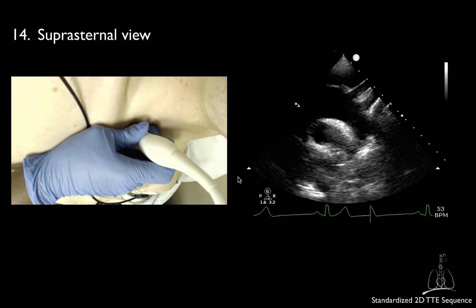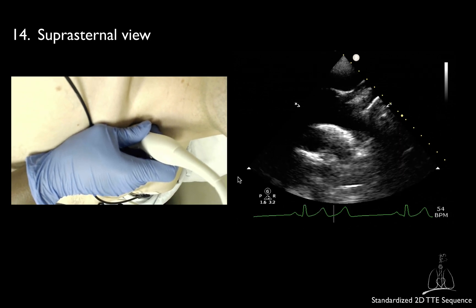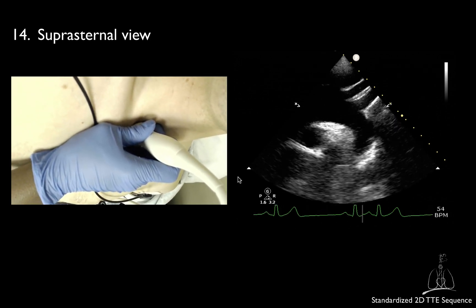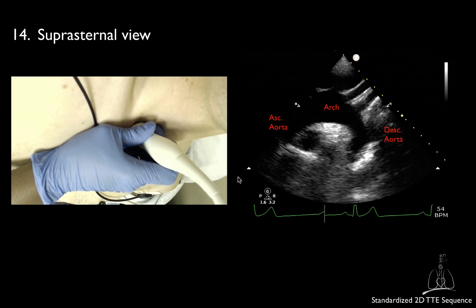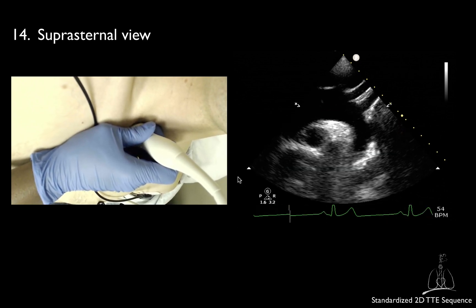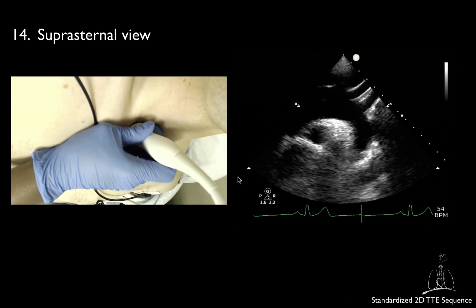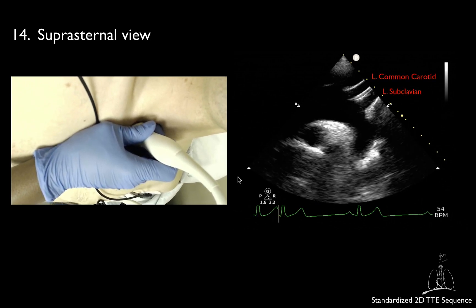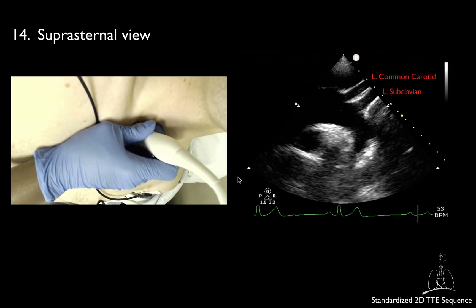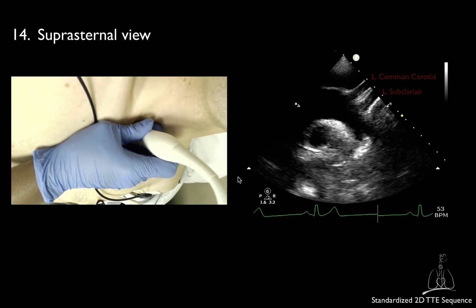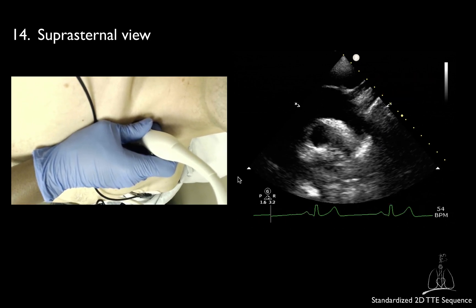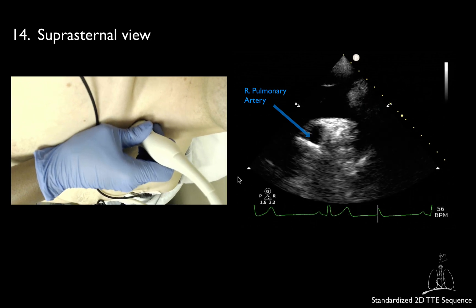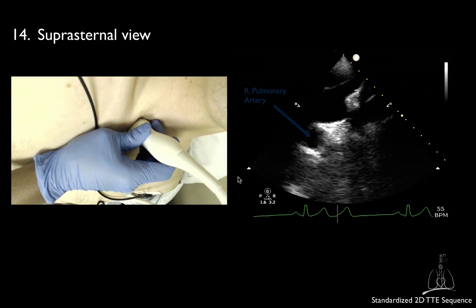The final step of the transthoracic examination is the suprasternal notch view, with identification of the long axis of the ascending aorta, the aortic arch, and the beginning of the thoracic descending aorta. Often, the brachiocephalic, left common carotid, and subclavian arteries can be identified. Finally, the short axis of the right pulmonary artery can be identified below the aortic arch.